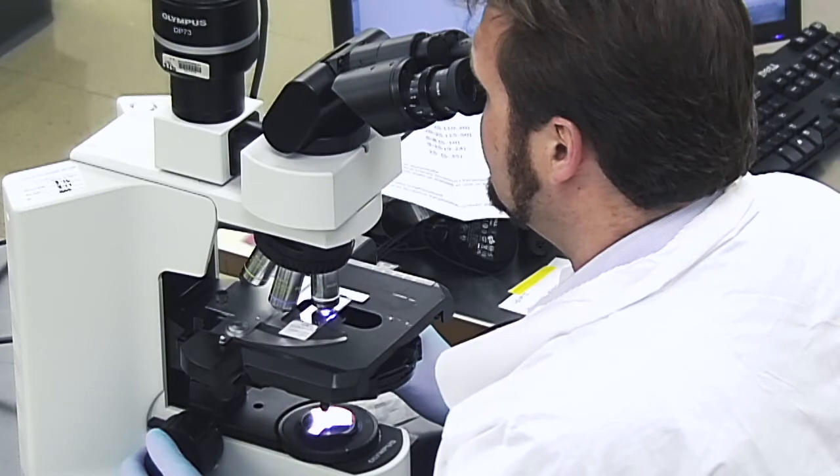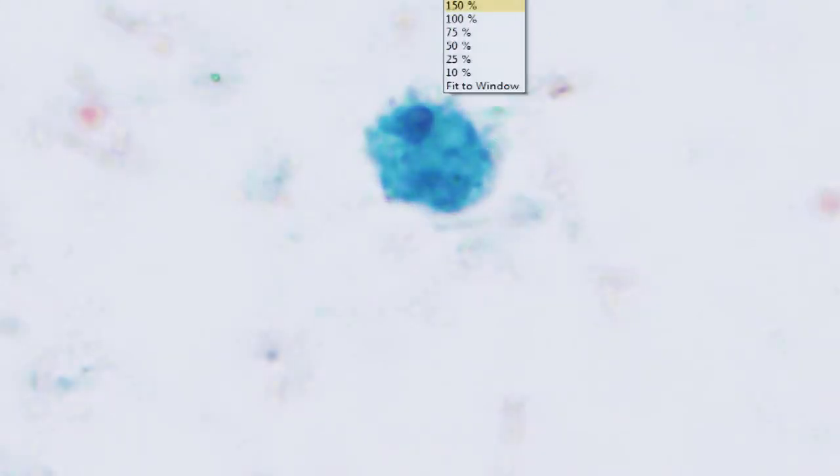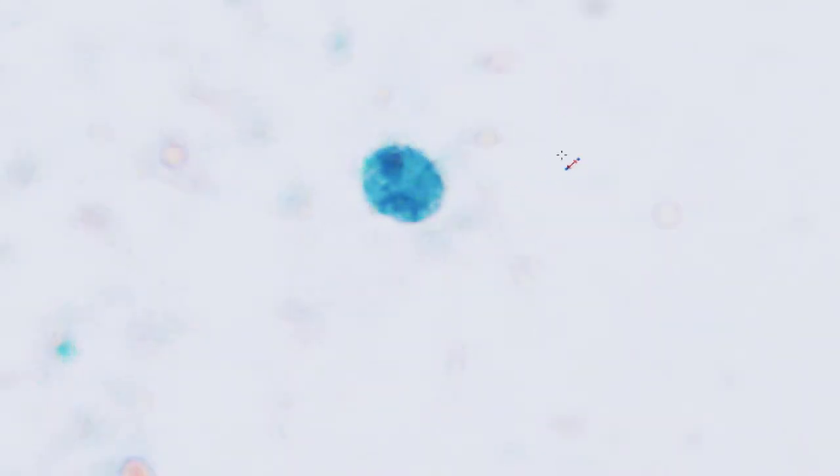Now, what is this here? This is interesting. Here I have a trophozoite of an Entamoeba. I'm going to take it down to the normal size to make it a little bit easier, but it looks quite small.